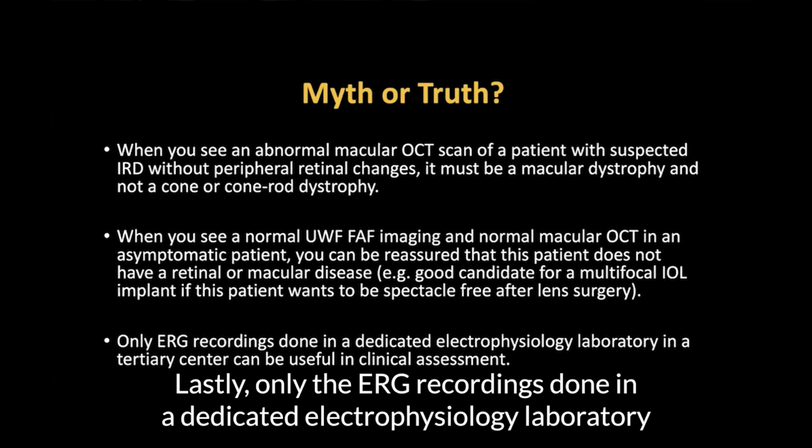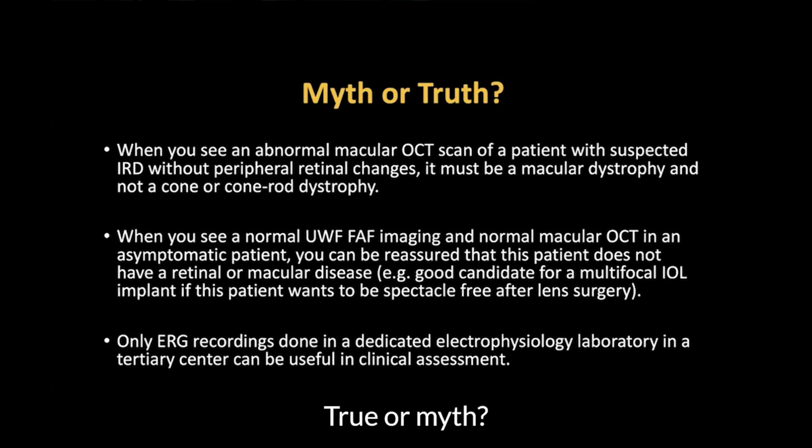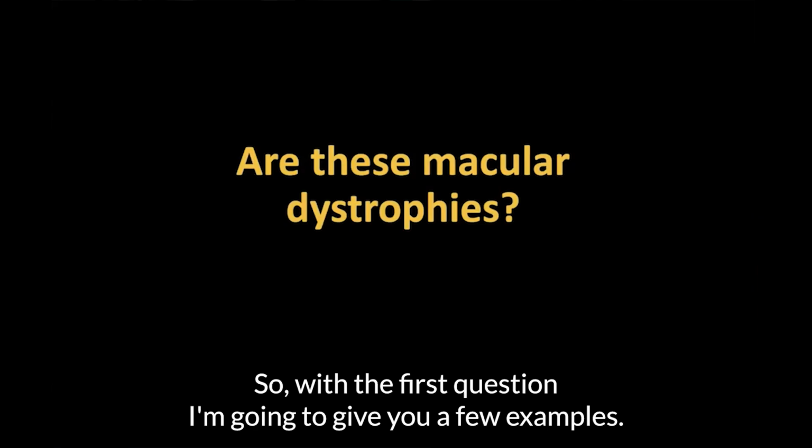Lastly, only ERG recordings done in a dedicated electrophysiology laboratory in a tertiary center can be useful in clinical assessment. True or myth? So with the first question, I'm going to give you a few examples.